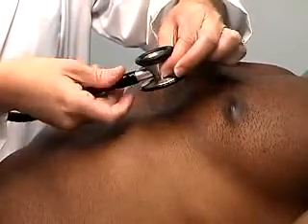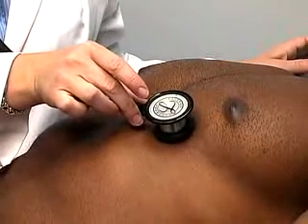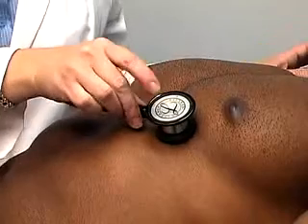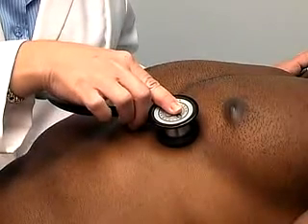Flip the head of the stethoscope to turn on the small side, the bell. Make sure you have removed the plastic diaphragm from this side. Place the bell gently against the skin to hear low-frequency sounds. Pressing the bell firmly against the skin makes it function as a diaphragm.